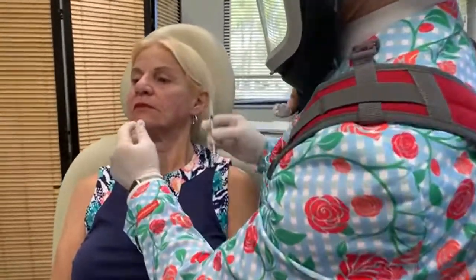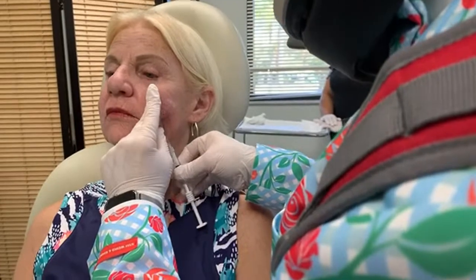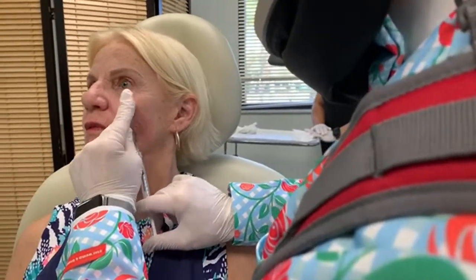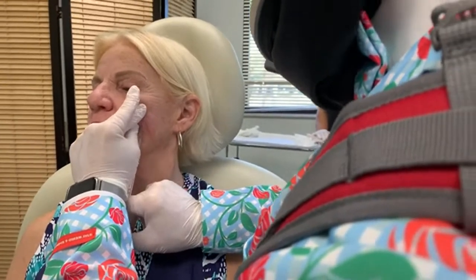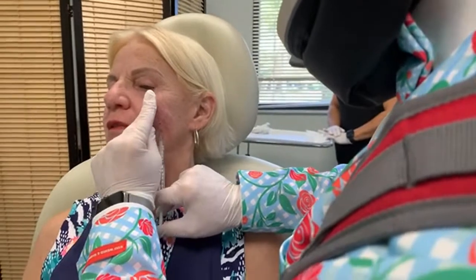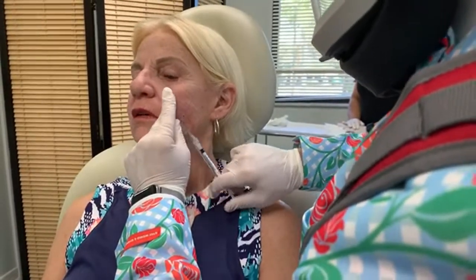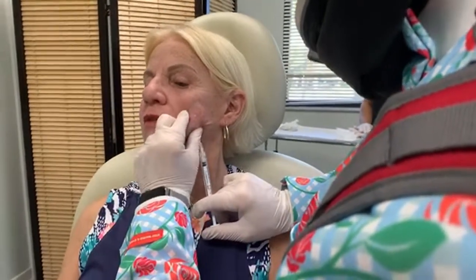Turn your head this way just a little bit. Pressure pinch. How many of these have you done? I've done over 20,000 syringes of injection. You get the hang of it after 20,000. Little pinch. That's a little subcutaneous, so she feels a little pinch there. We'll go slowly. We're right on top of the bone. I like to do some of it on top of the bone and some of it right below the skin. So I mix that up. Everything's looking good.